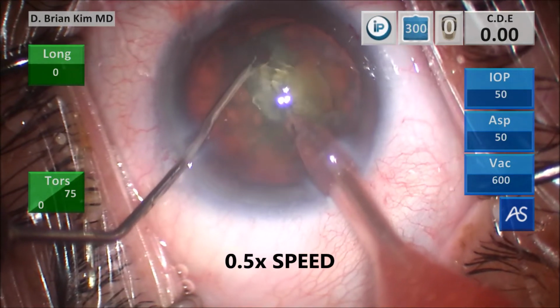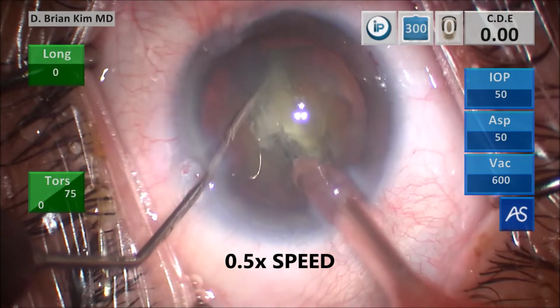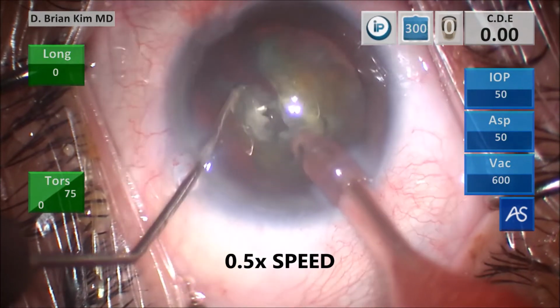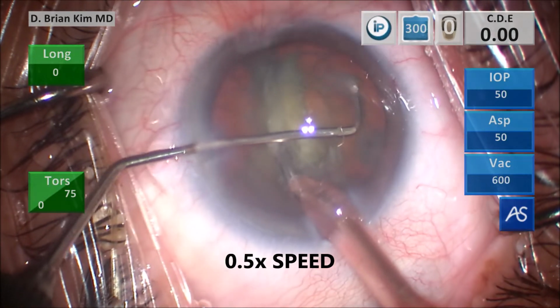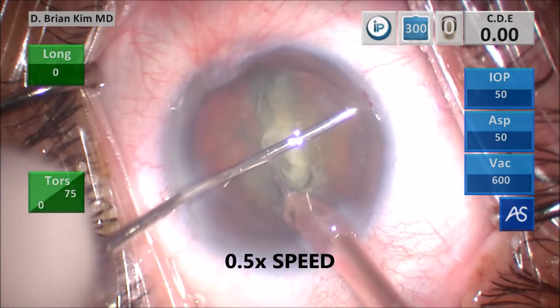There's no up or down movement. There's no tilting. There's no traction on the zonule. So again, any critics who think that this is dangerous, again, you can see in slow motion, there's no traction. Again, centrally directed forces, very, very safe to the zonules.